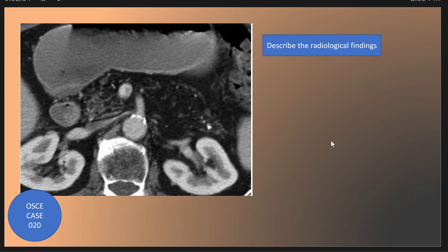The first question: describe the radiological findings. As we see here in the local CT scan after contrast, we have diffuse fatty infiltration of the pancreatic areas. The patient has a history of receiving steroids for chronic obstructive pulmonary disease. Can you remember the phase of this CT scan? This is the corticomedullary phase. The fatty infiltration involves the body, the neck, and the tail of the pancreas.